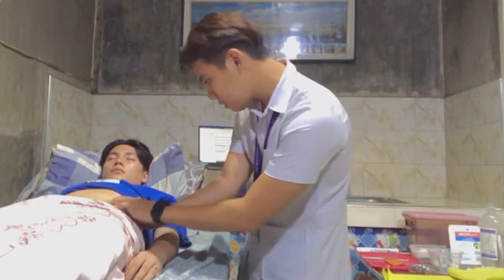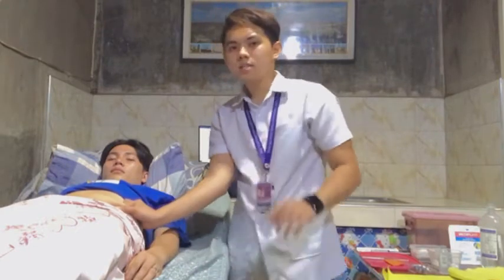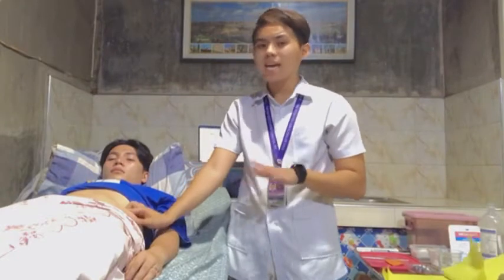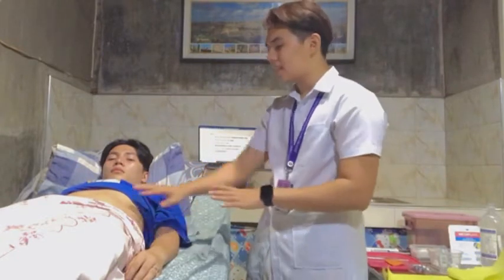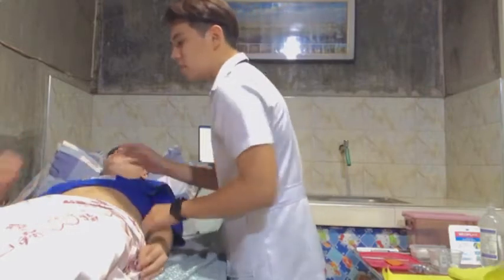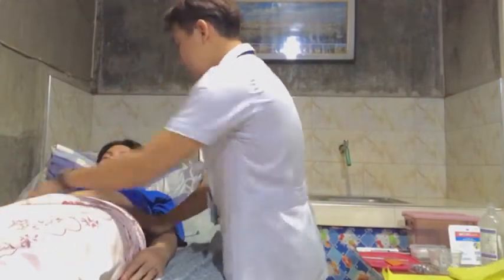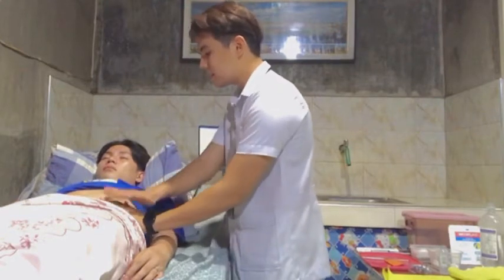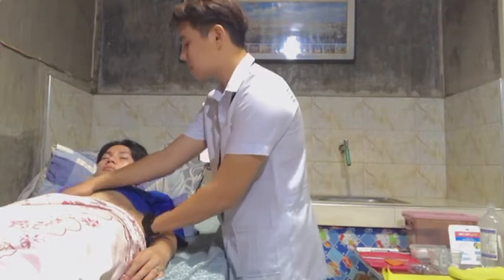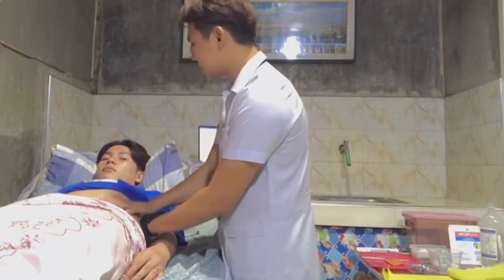So we will be using a 1 ml syringe here, okay? After that, we need to place the patient in a comfortable position and ask the patient to relax the area you are about to inject. Okay, sir, I'm going to adjust it here. I will be administering the injection here, sir, in the left lower quadrant, okay? So just relax. When did you eat your breakfast, sir?